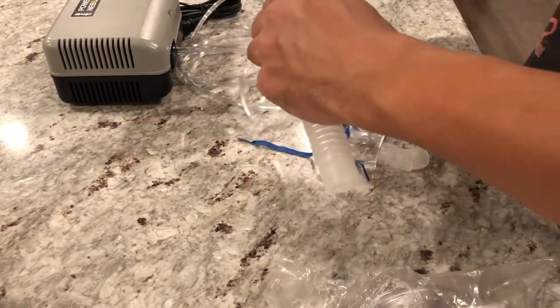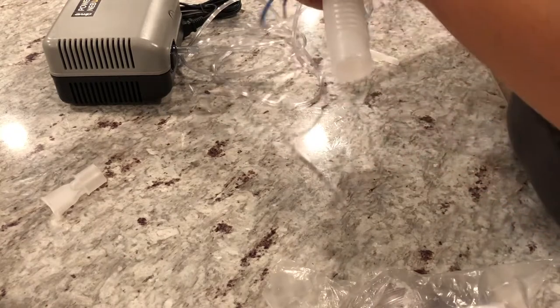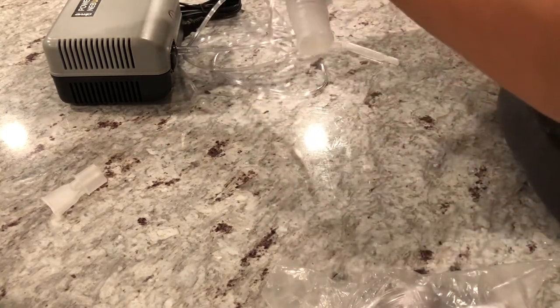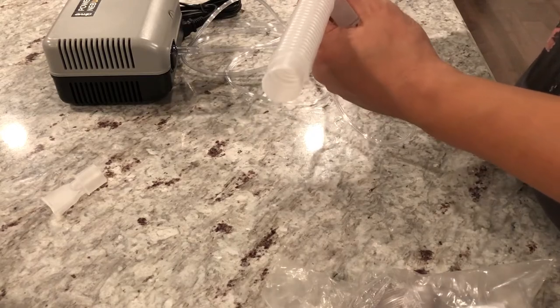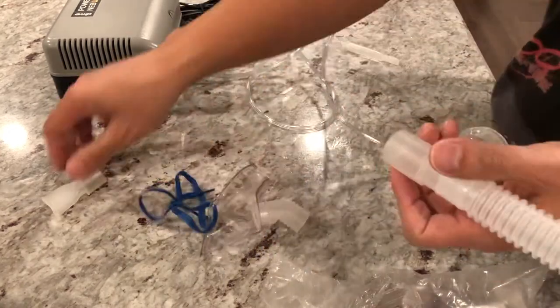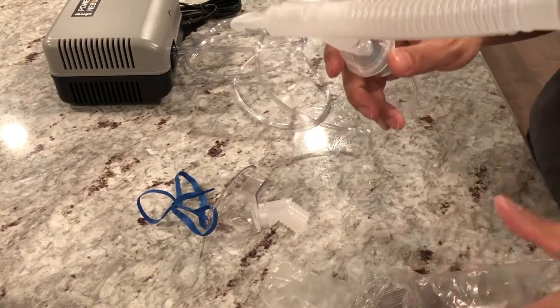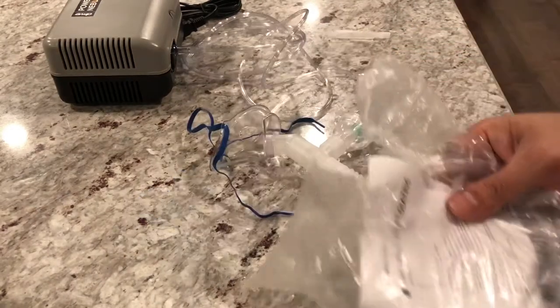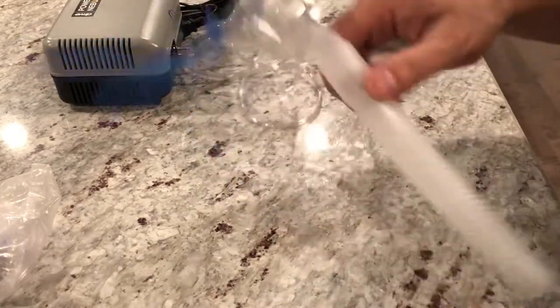So I'm basically just going to take this and instead of the mouthpiece piece, swap it out and use it like that. There we go — that makes sense. This goes like that, and this will go right on my son's mouth and nose area. This thing spins so you can adjust it however you need to. I'm going to set the original mouthpiece aside since we have our face shield on now.